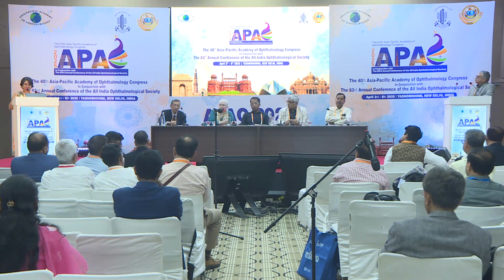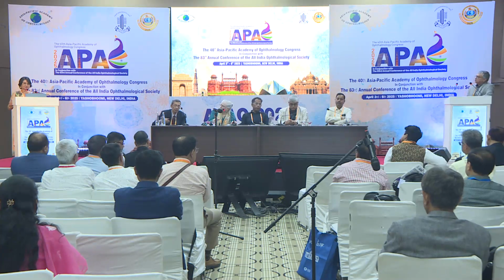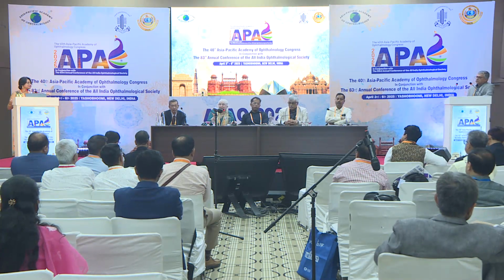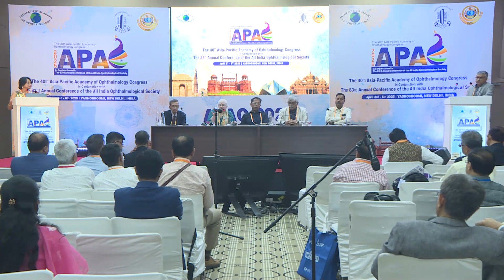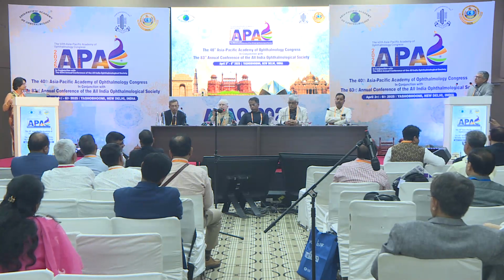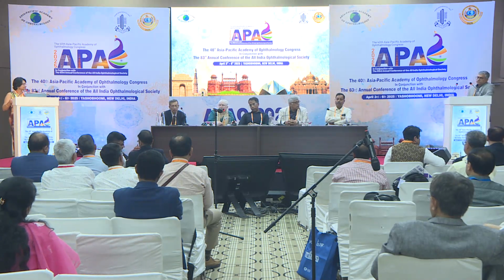We are fine. The surgeon should know that the AC will become deep. There may be a zonular dialysis or there may be a PC break already there. So in those cases, they can go ahead and do cataract surgery after 1 month of the retina surgery. There's no issue, but the surgeon has to be experienced in knowing that there are challenges when they do the cataract surgery.